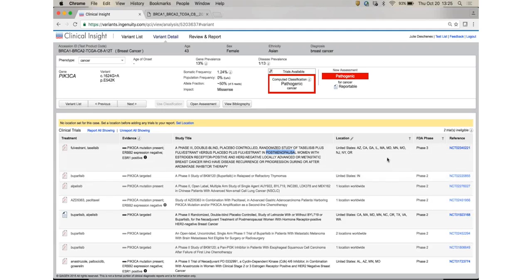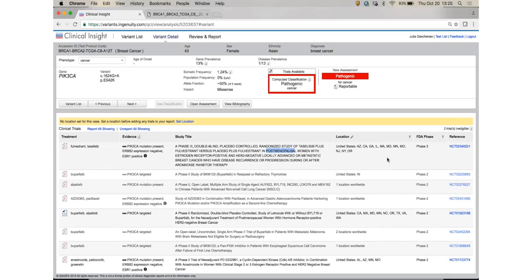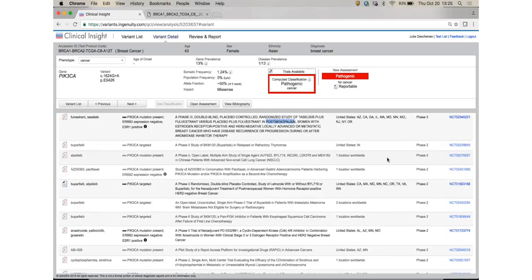But when you take a look at all the other clinical trials, there is a lot of them. I'm not going to take a look at all of them today, obviously. Some of those clinical trials are in dark. They are, again, against the PIK3CA inhibitor, targeted. Some of them are relevant. For example, this one here, where you have HER2 negative again. There's a different state or worldwide location when they are outside of the United States.